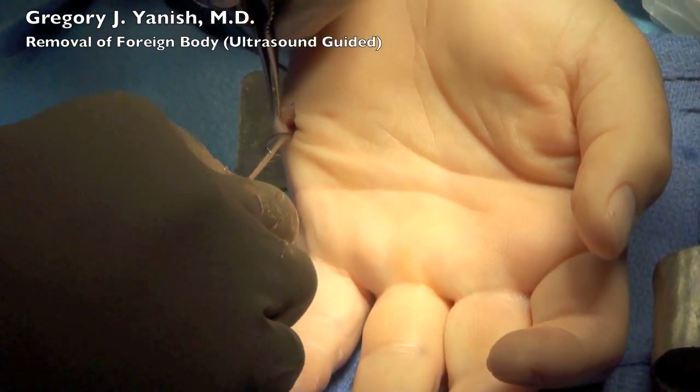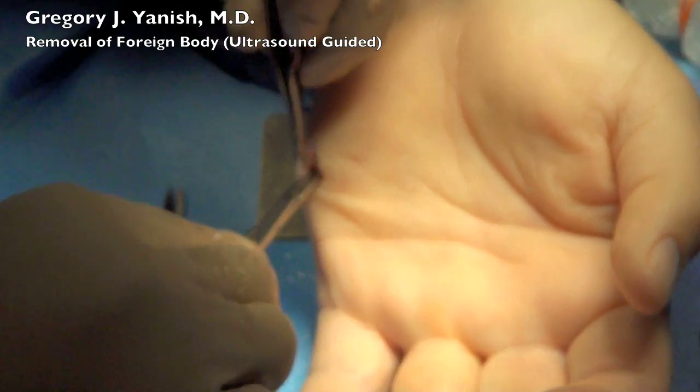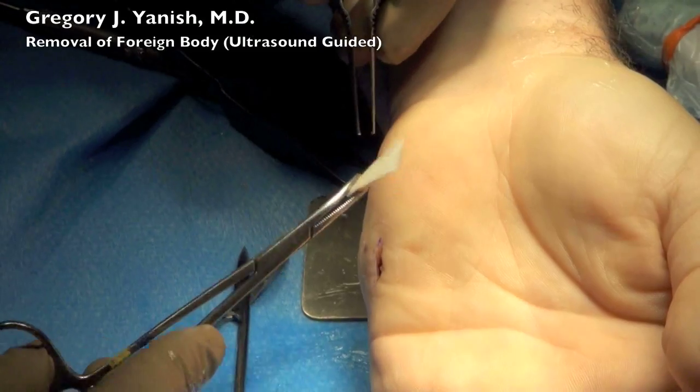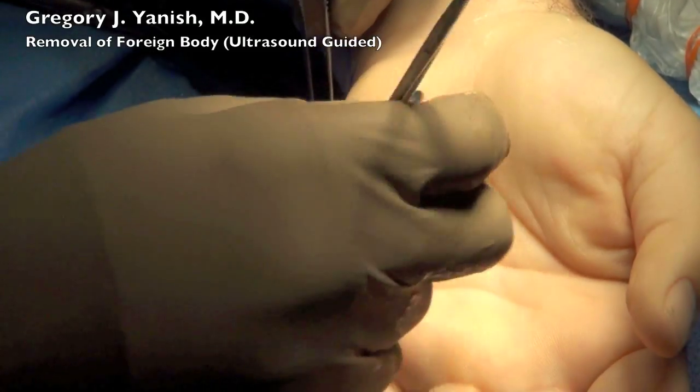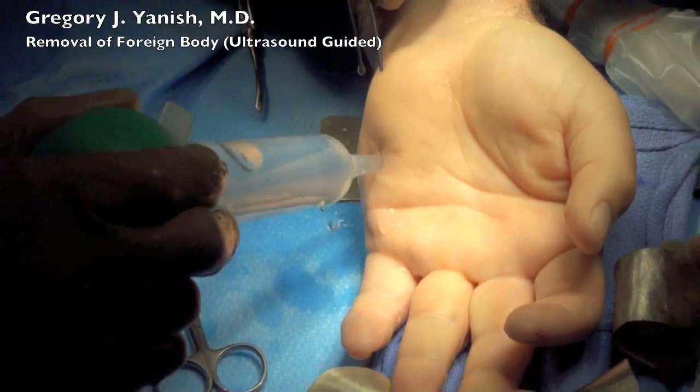And then a very focused dissection is taken right down to the ceramic fragment. The hemostat is then placed into the wound, and the tip of the fragment is gently grasped, and it is retrieved from the wound. The wound is then irrigated with saline.